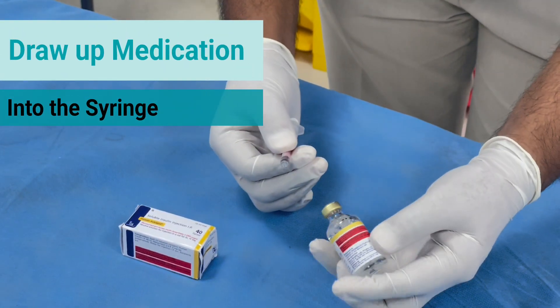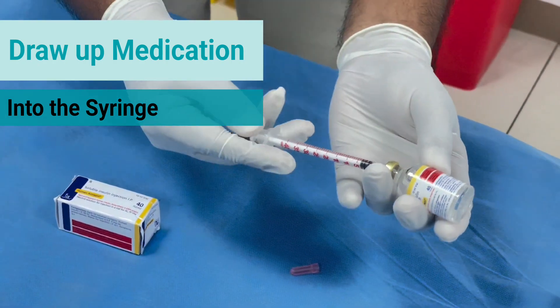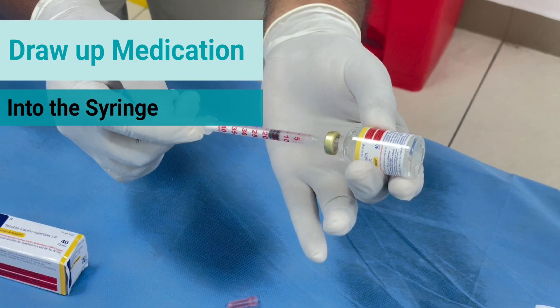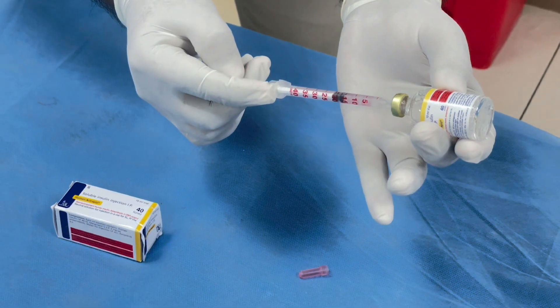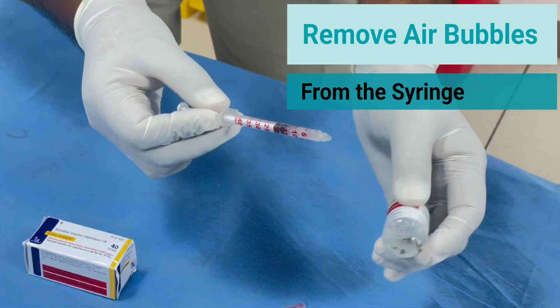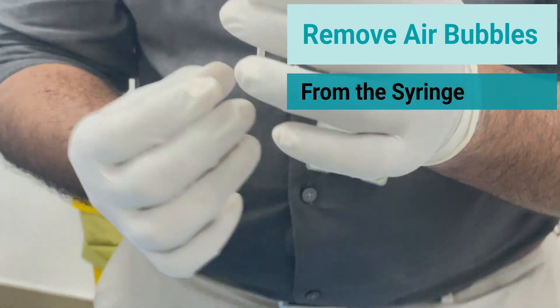Draw up the insulin into the syringe. Ensure that you take the correct units as prescribed by the doctor to prevent wastage. Ensure that air bubbles are not present, and if present, remove the air bubbles from the syringe.